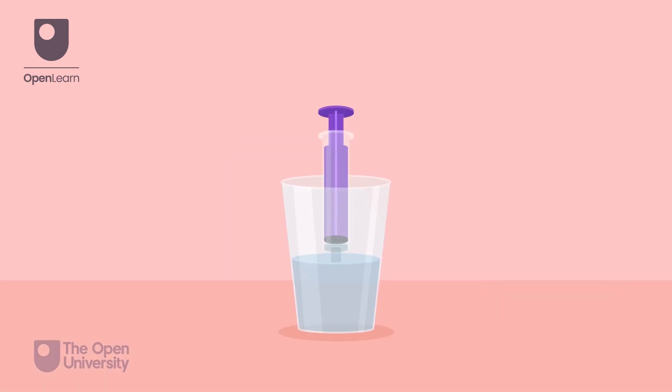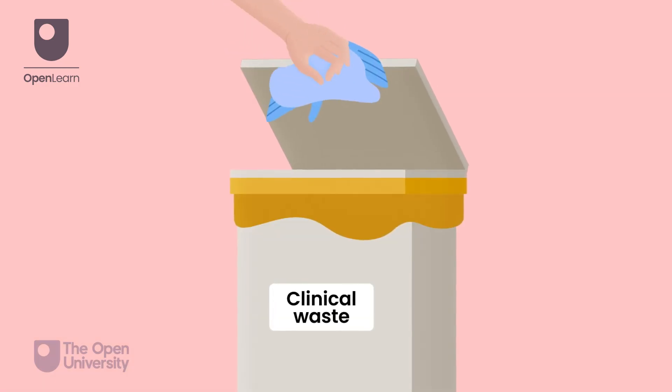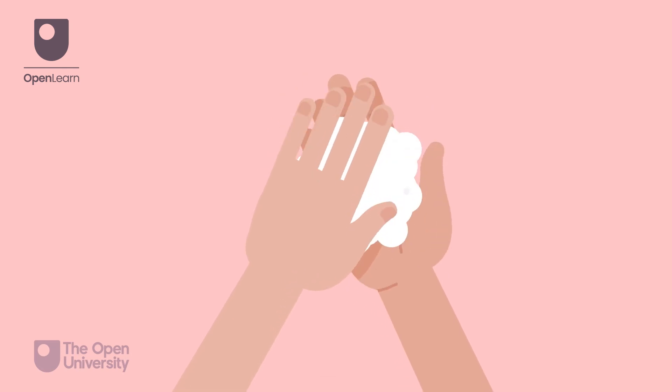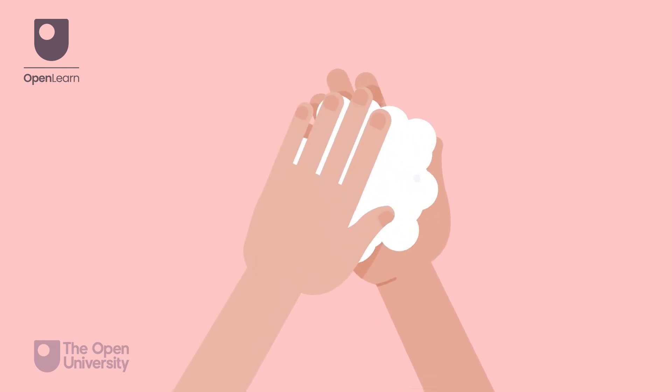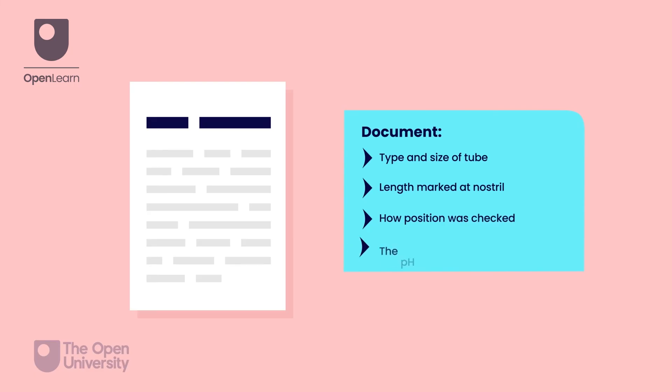Flush the tube with 30 millilitres of water. Dispose of equipment and PPE appropriately and perform hand hygiene. Document the type and size of the tube, the length marked at the nostril, how the position was checked, and the pH obtained.